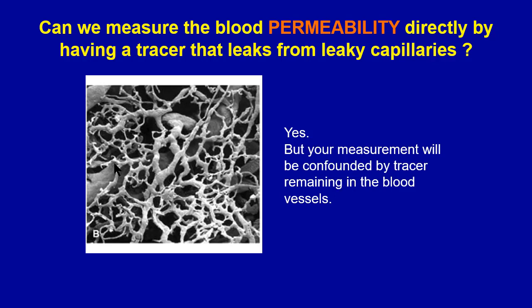You might be thinking, well, why don't we do a subtraction? We had previous measurements, so now let's just do a subtraction. Yes, and that has been done too, but can I ask you then, will your large particle tracer go into the small vessels? The answer might be no. So hence, the technique is confounded.